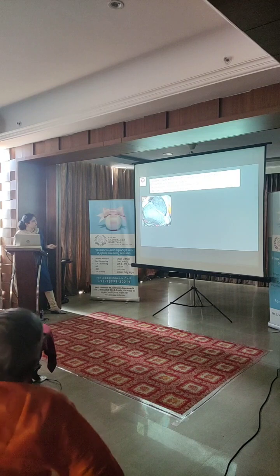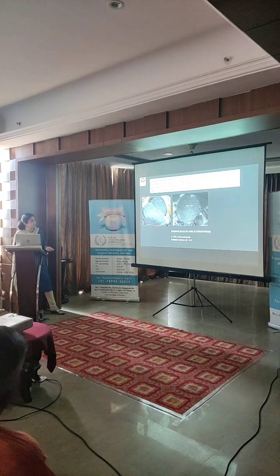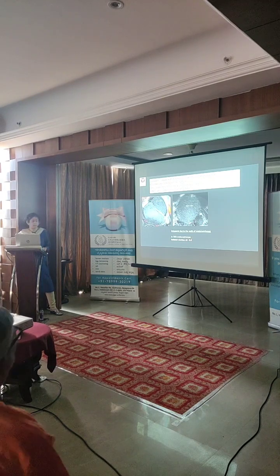And if you look at the walls of these endometriomas, you see they're very smooth, regular. You may see these hyperechoic foci that I was saying. They're very specific of chronic hemorrhage, and they're believed to be cholesterol crystals. They have a very high LR for an endometrioma, but they're only seen in 1/3 of endometriomas.